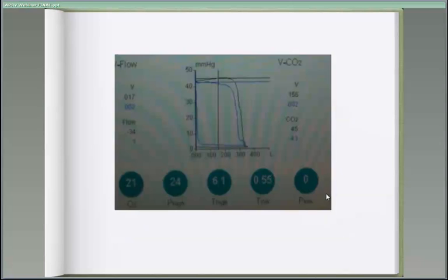Now I just want to focus a little bit about ventilation again, and this is a volumetric CO2 tracing. This is from the lab that we are involved with up in Upstate Medical Center, Gary Nieman's lab. What we're doing here with pigs is we're actually ventilating them with conventional ventilation. You can see the blue line here is conventional ventilation. That line shows that as you exhale, there's a little bit of dead space because the end tidal CO2 does not rise initially. And as it goes up, you see eventually the end tidal, I'm just getting my pointer here, you can see that the end tidal hits 40.